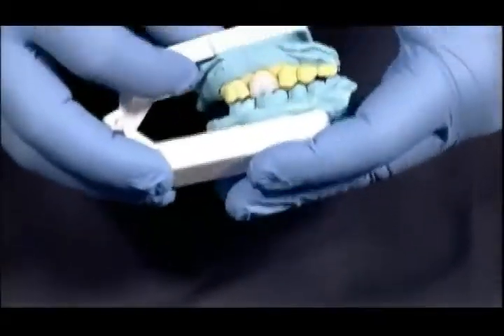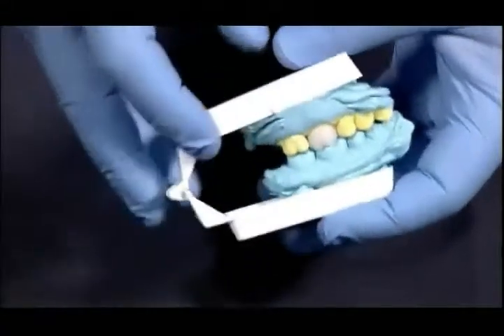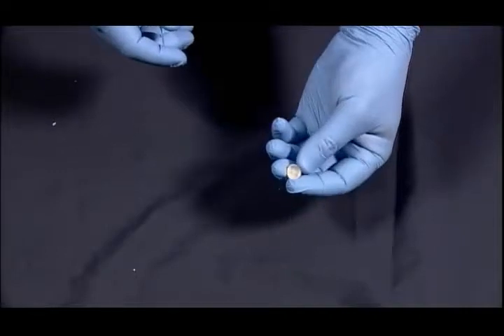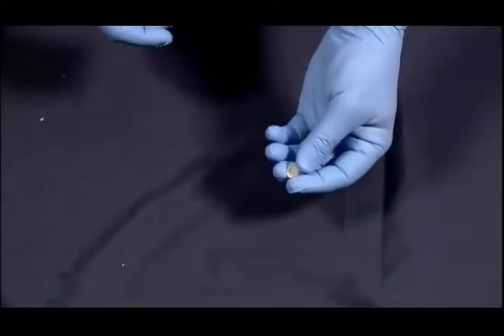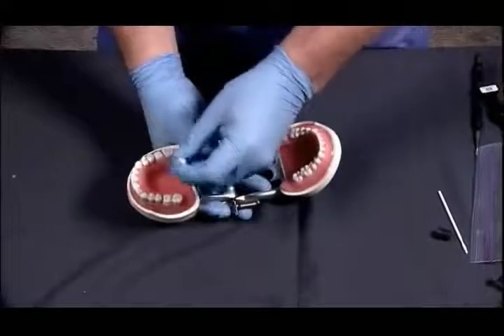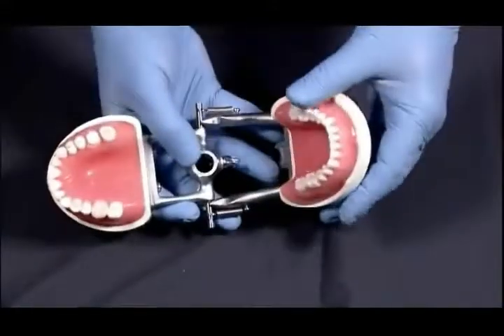We'll test the bite, make sure that we're getting pretty close with the occlusion. The final occlusion will be adjusted in the mouth using the human articulator. And from here, what you will do to get it cemented, you'll once again sandblast the internal aspect of the crown form and go through your normal resin bonding techniques that you use for any type of an indirect resin restoration. We'll take our final crown form, go back to the patient, and test it in and make sure that we have it fitting appropriately on that particular tooth.